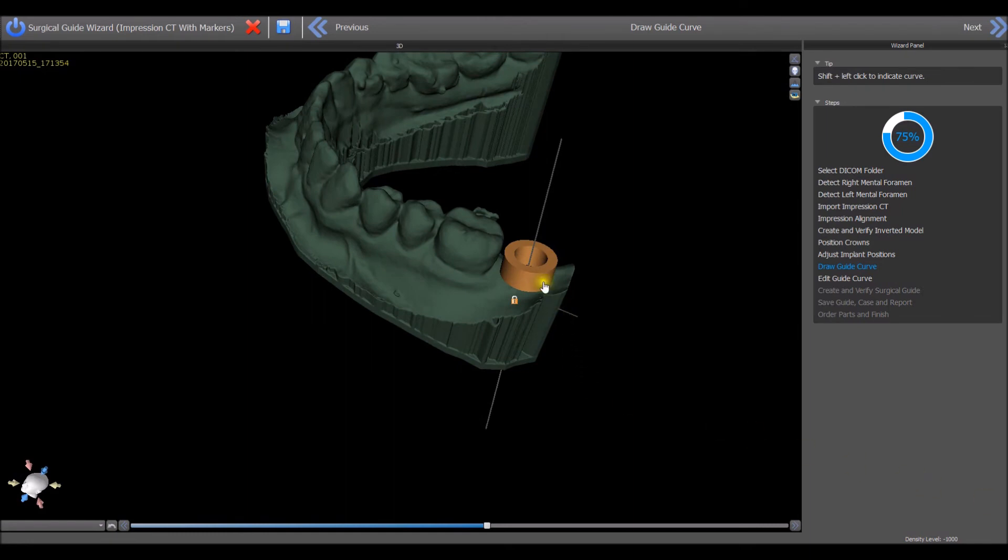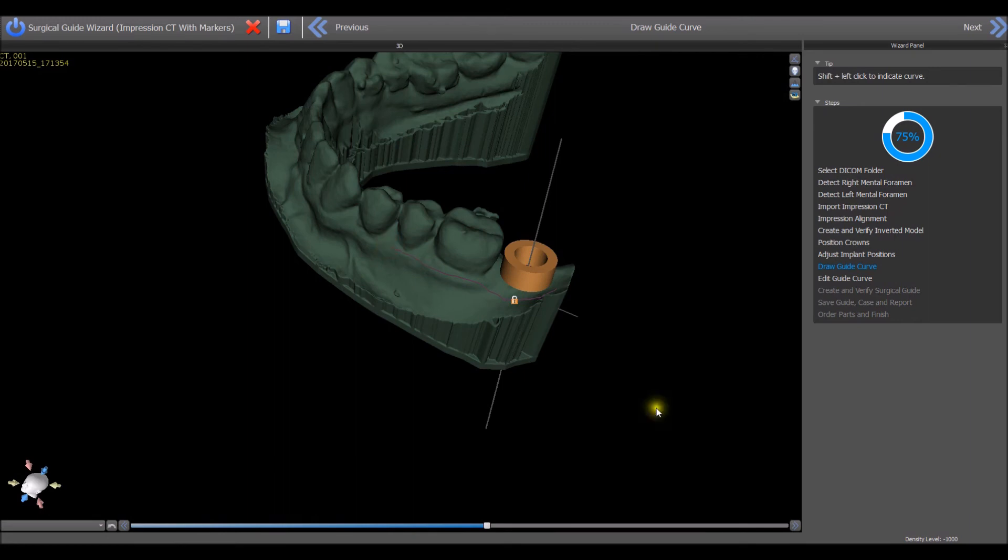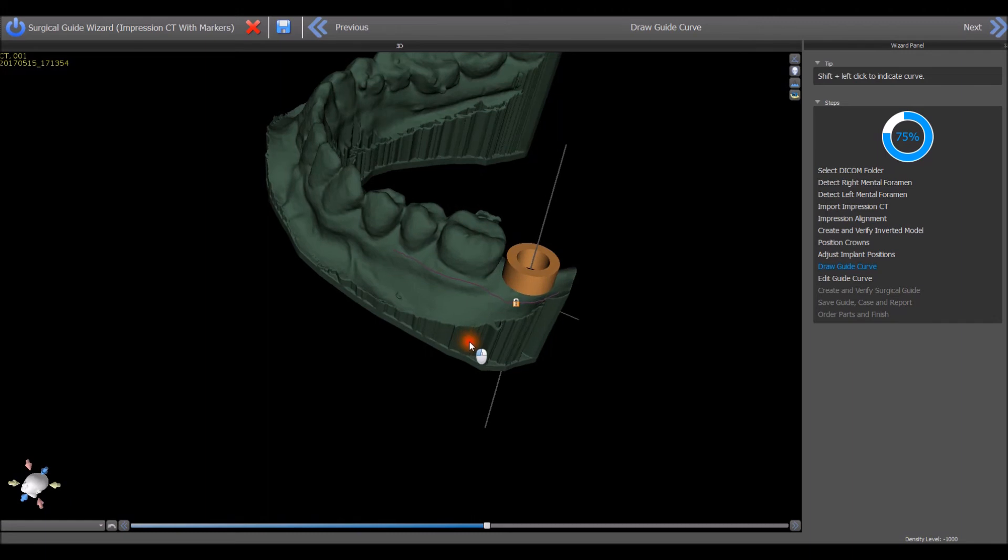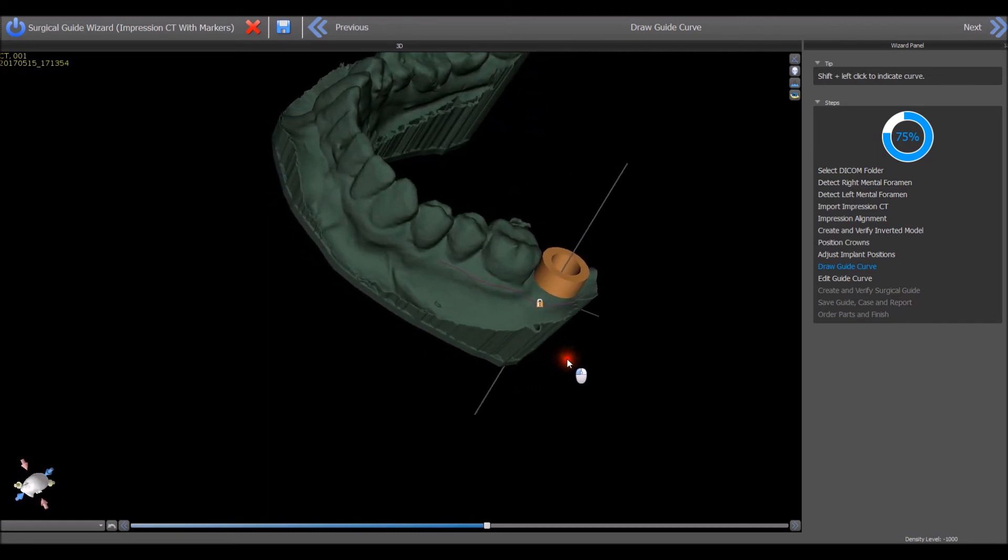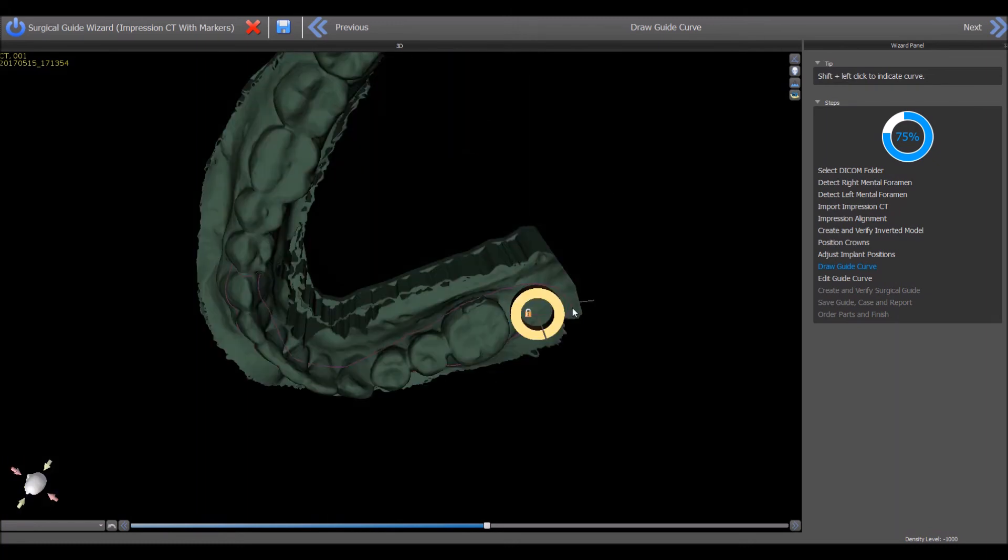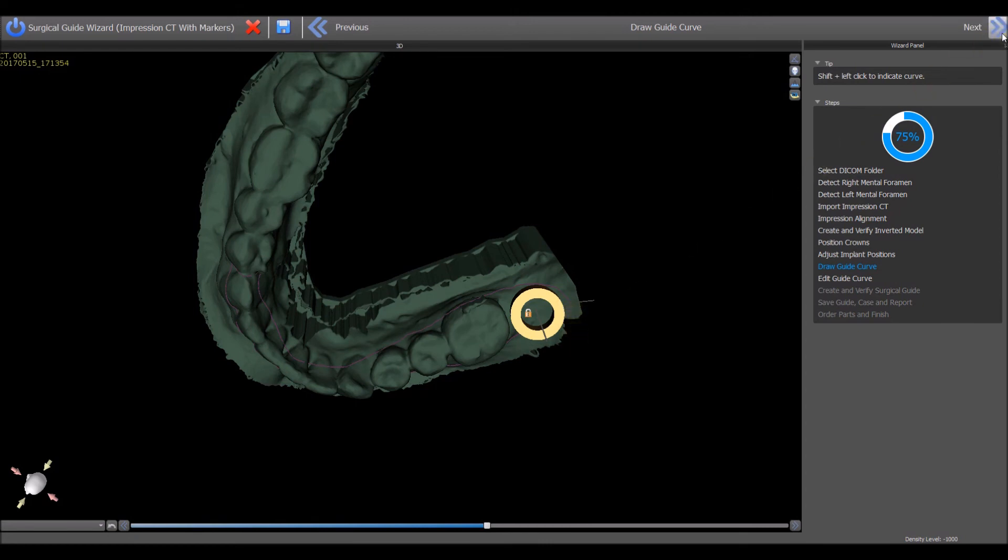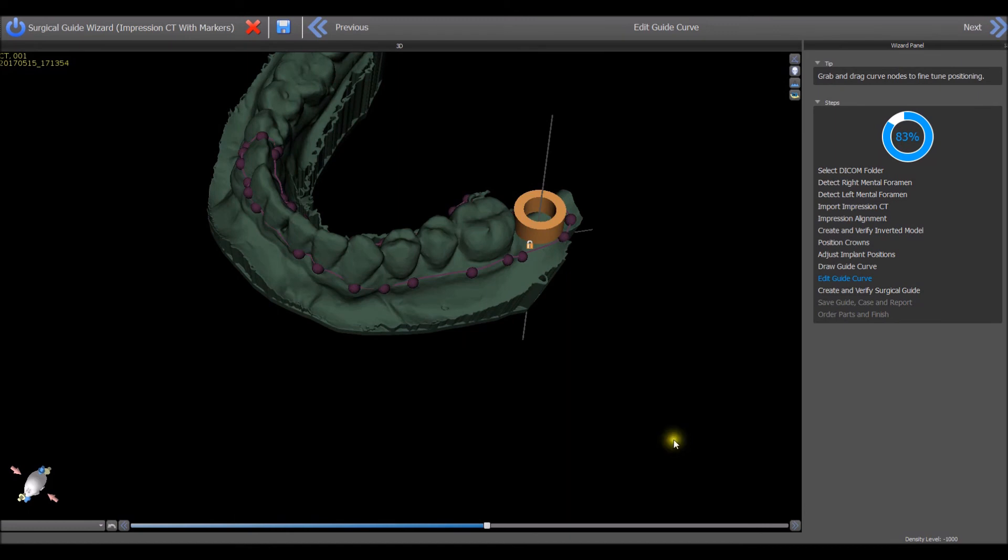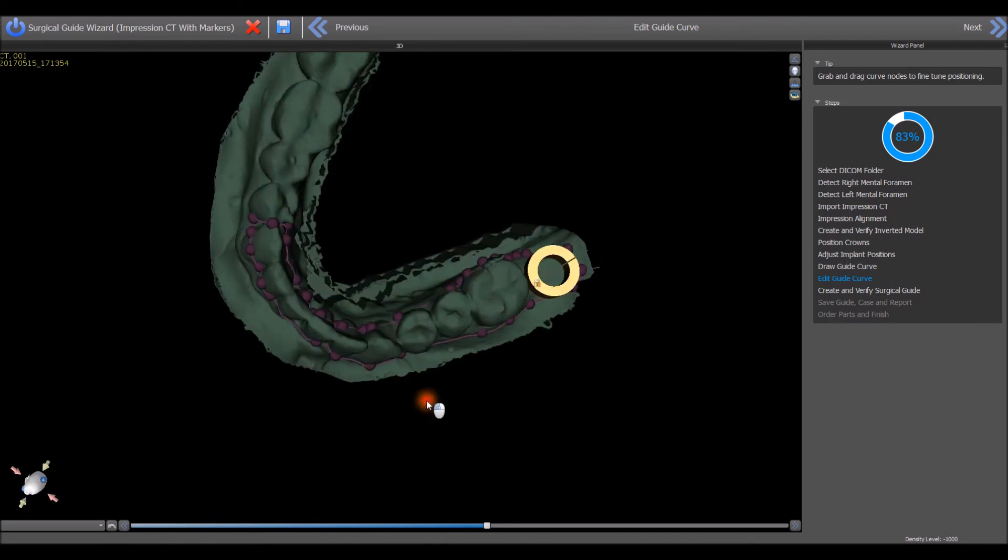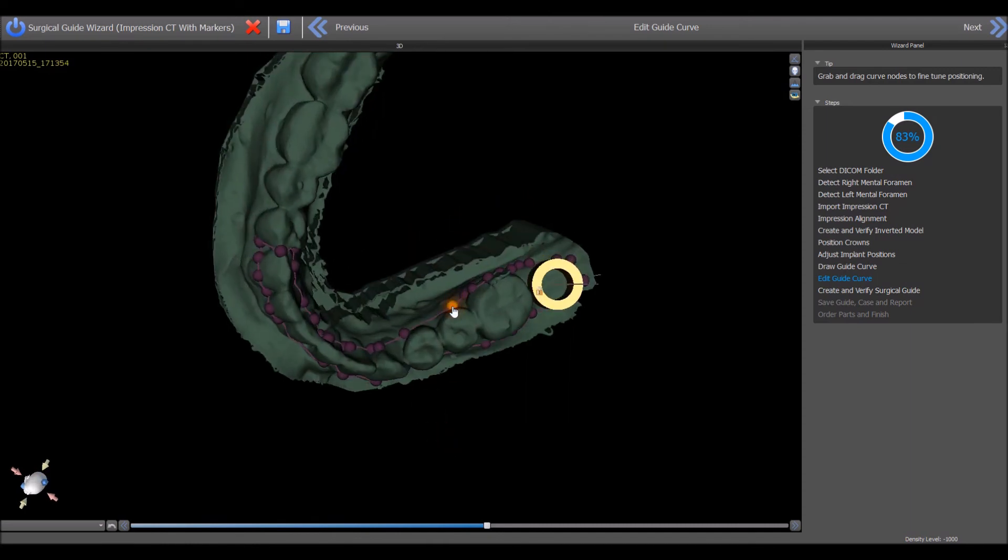Hold down the Shift key and the left mouse button to define the area for surgical guide fabrication. Release the Shift key and hold the left mouse button to rotate the model as needed and press the Shift key again and left drag to continue drawing the curve. Draw the entire curve and close the loop by returning to the original start position and then pressing the Next button. Hold the left mouse button to grab and drag any of the nodes that appear along the surgical guide curve to fine-tune the curve positioning and to straighten any crossed segments. Press the Next button upon completion.